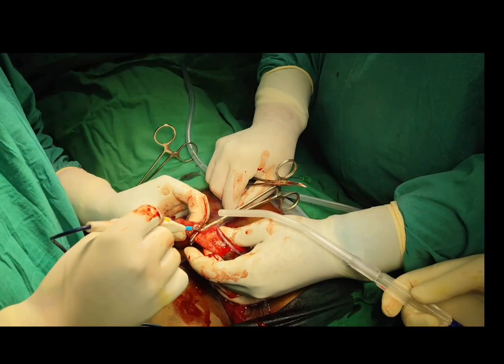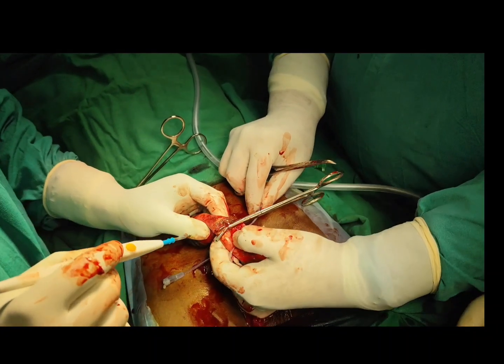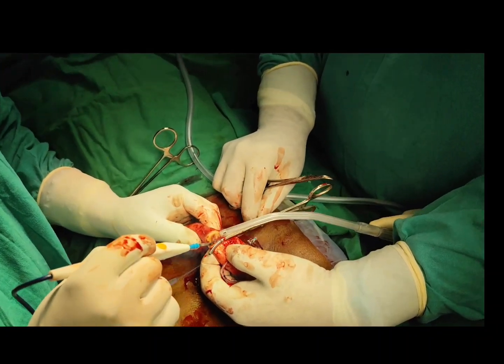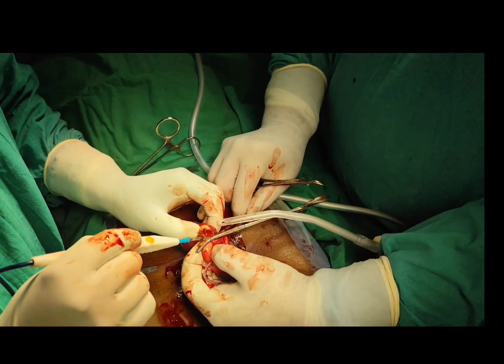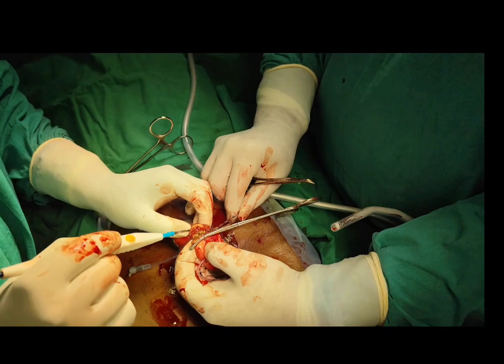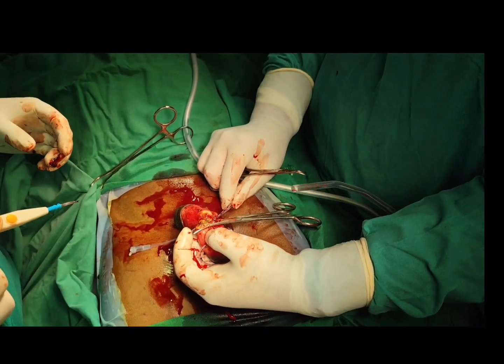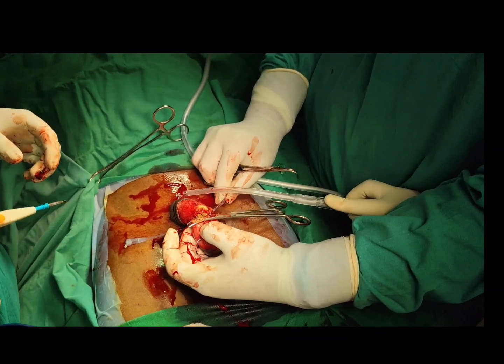We have injected lignocaine. We have identified the dorsal artery and dorsal vein of the penis. Then now we are ligating the corpus cavernosa. Here the corpus cavernosa is being dissected, and the corpus spongiosum we had identified and preserved.